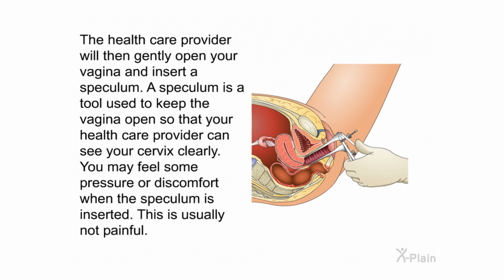The healthcare provider will then gently open your vagina and insert a speculum. A speculum is a tool used to keep the vagina open so that your healthcare provider can see your cervix clearly. You may feel some pressure or discomfort when the speculum is inserted. This is usually not painful.